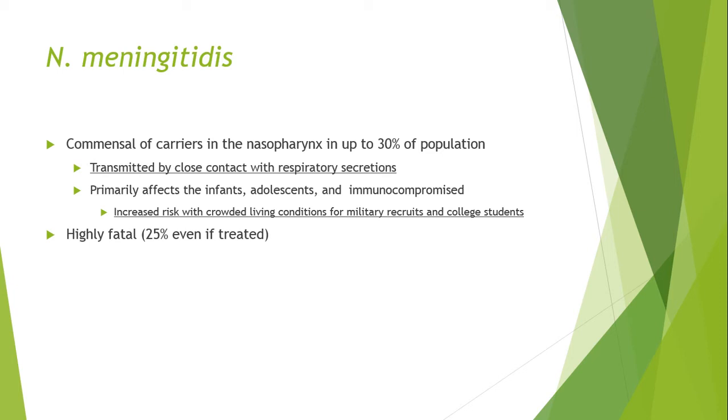We'll test it. Well, Neisseria gonorrhea gets this test, and several other organisms like Moraxella catarrhalis will commonly get this test.